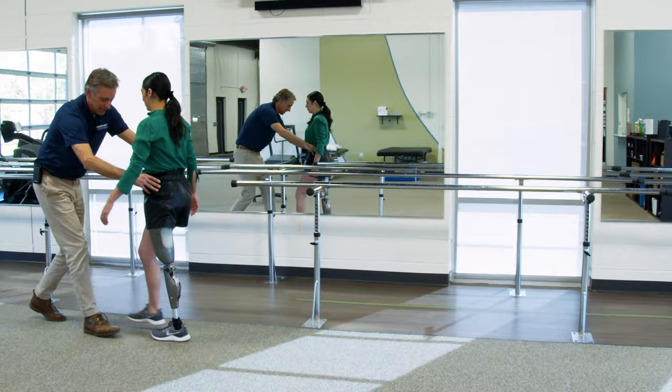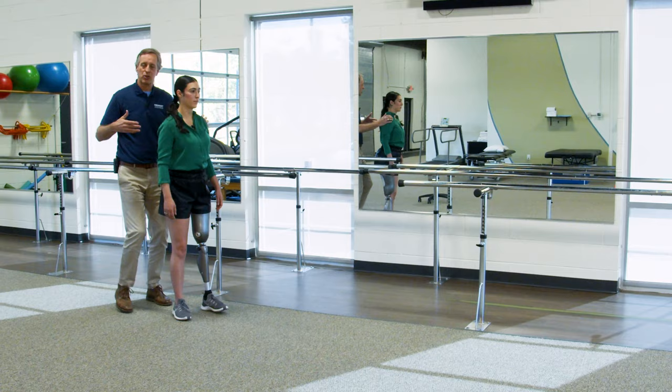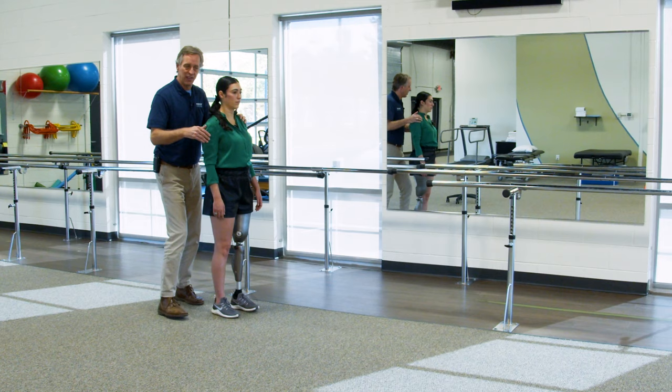Now you'll notice as she started to move, her arm started to swing. Because as I'm creating some energy and pushback, that gives her some impetus to try to get me out of the way. Think of a sprinter running down the track. They don't have their arms at their side, right? For great energy and power, their arms are moving.